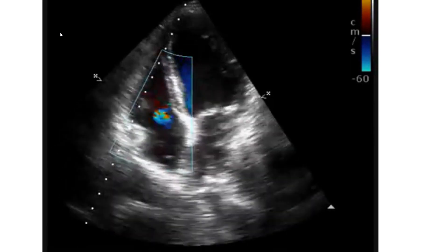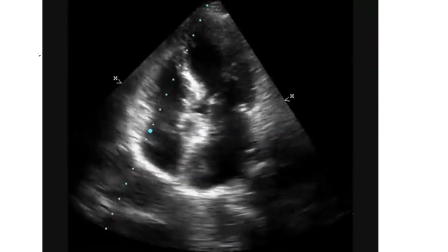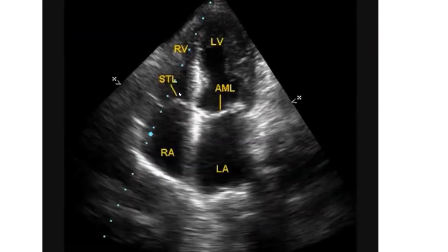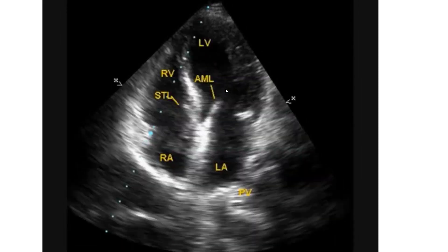This is an echocardiogram — an ultrasound imaging of the heart. You can see the heart contracting here very well. This is the septal tricuspid leaflet and this is the anterior mitral leaflet, seen here in the open position.